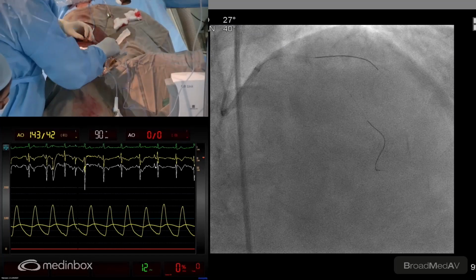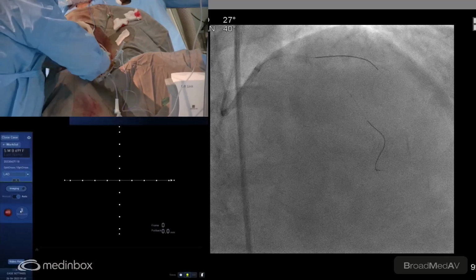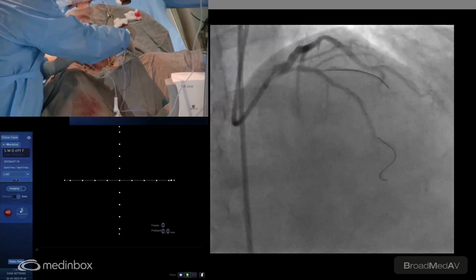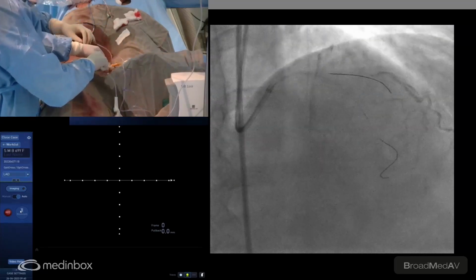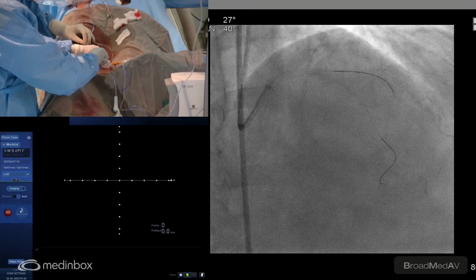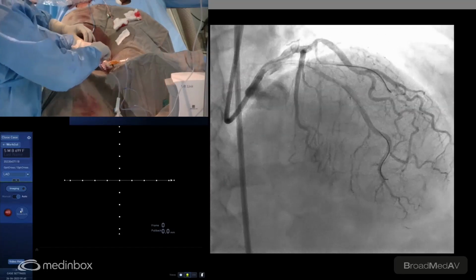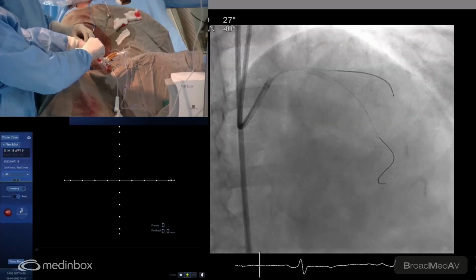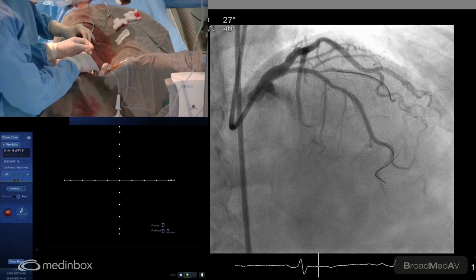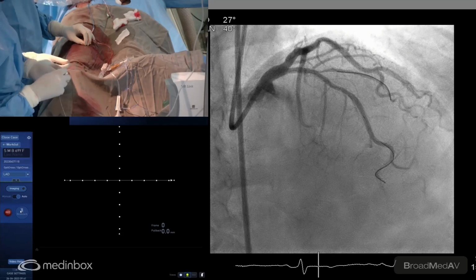So before the IVUS, as my technician Freddie said, we should give some NTG so that the vessel is not undersized in the whole bargain of doing the stenting. So here you can see that the vessel is coming up nicely. We'll take a shot now. So the vessel looks much bigger now. It seems to be a 3+ vessel now, earlier thought of 2.75 at the distal, but it looks beyond that. Probably the imaging will give us a better picture in this scenario.